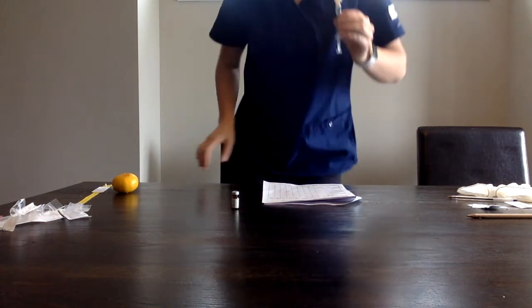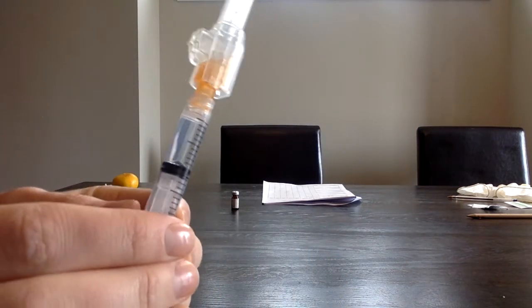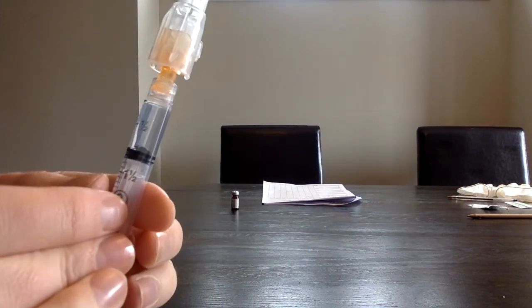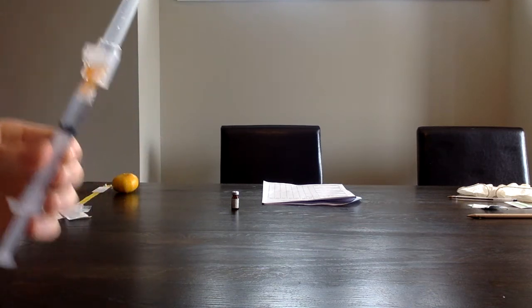And then I also want to verify with the camera, so I wouldn't leave my meds unattended, but for demo purposes, I will show the camera. So we're at the 1 ml mark. And there's no bubbles, and there was a bleb at the top.